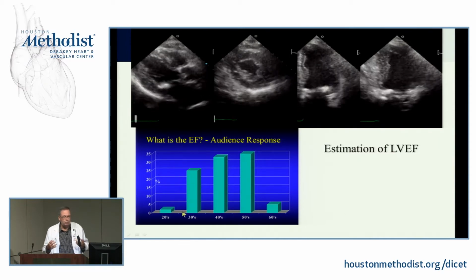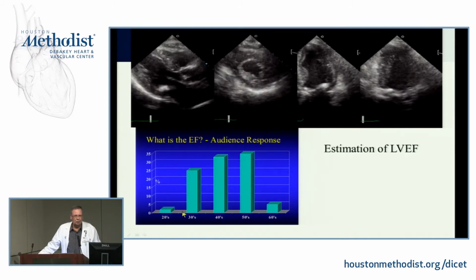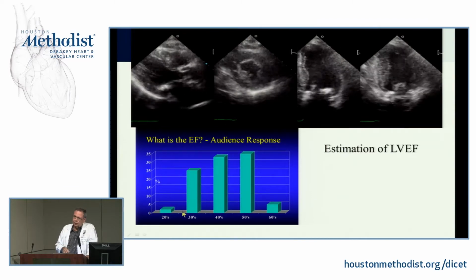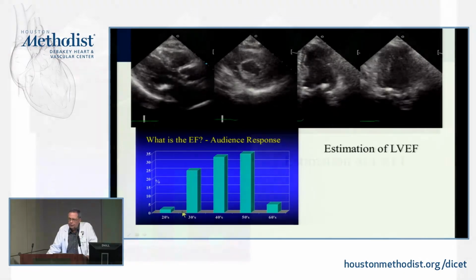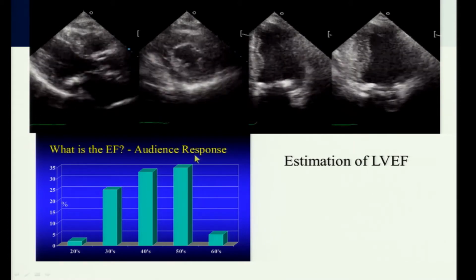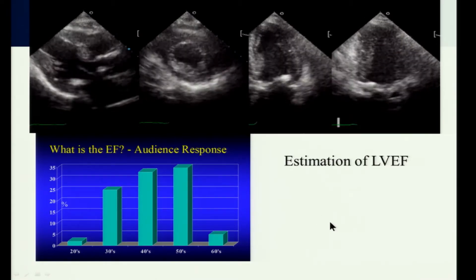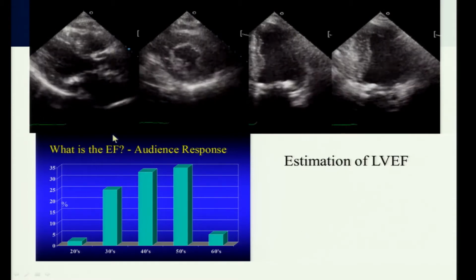If you're the patient, you probably would have a little trouble with that level of spread when it comes to your heart. And what this shows you, looking at an audience of over 100 cardiologists in a room, all of them practicing cardiologists who do echoes in their office, are the problems that we have with this subjective technique. It can be done well, but it has to be done by experts. So a few tricks that I can share with you after 40 years of doing this.